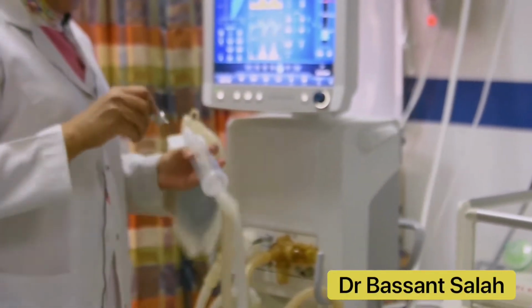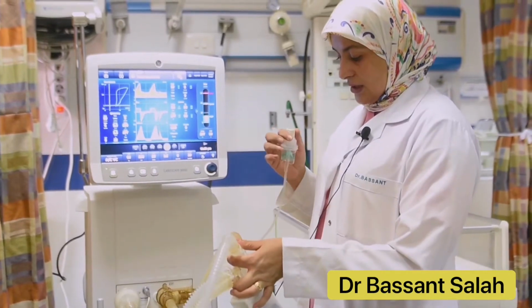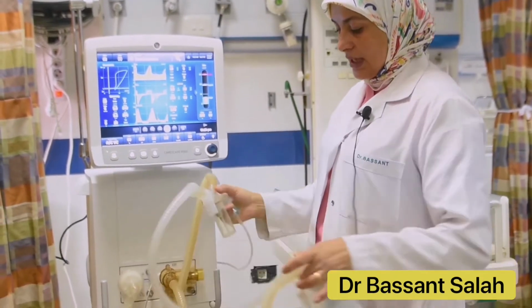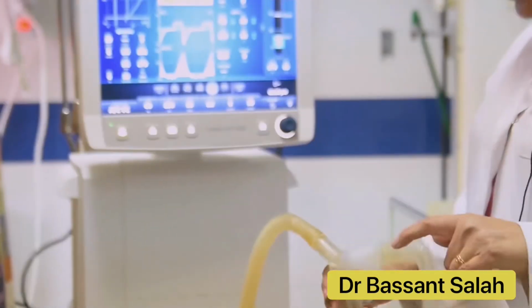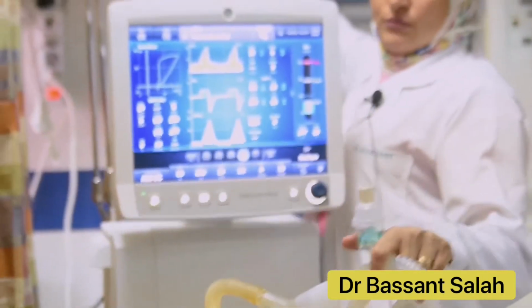The second method to connect a nebulizer to the ventilator is through the pneumatic jet nebulizer. The pneumatic jet nebulizer is connected to the outlet of the wall through oxygen or through air, and I choose here to connect the jet nebulizer close to the patient, away from the ventilator, and after the heated humidified circuit. I connect it here. As you can see the flow.